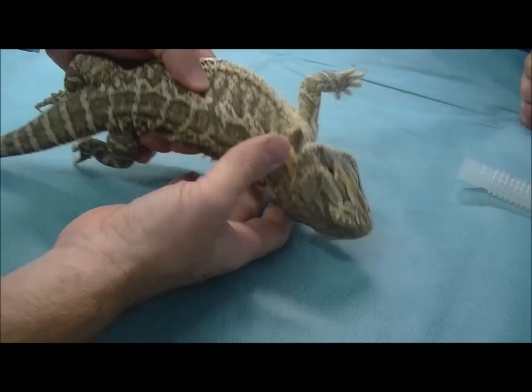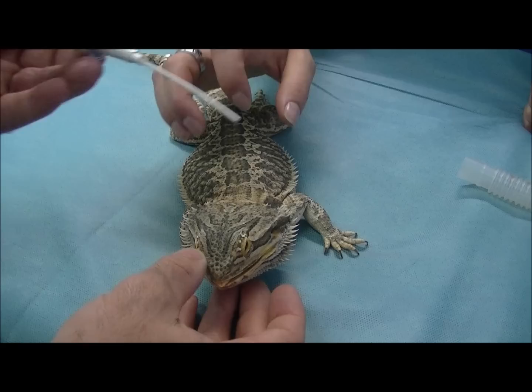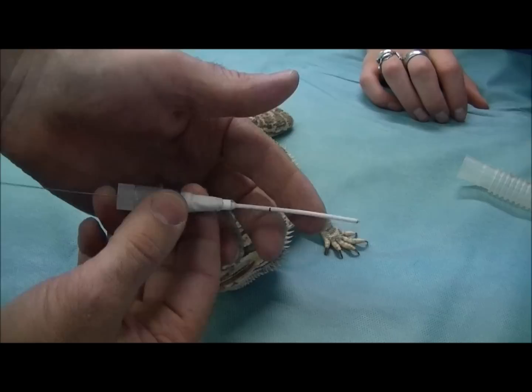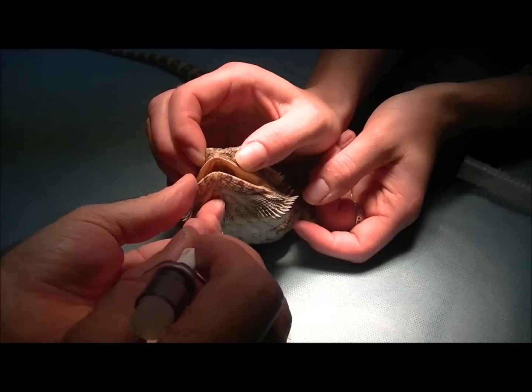We've given her the L-faxan, and you can see now she's anaesthetised. Normally a dragon won't lay like that. She's asleep enough that we can actually open her mouth — you can see quite a fleshy tongue there, and we've got to try and get down behind that. We're going to be using special little ET tubes made for reptiles. They're a silicone-based tube. We've made some modifications — they're normally a bit longer but we've cut them down shorter, and I've put some white electrical tape on them because they're quite delicate and the teeth can sometimes puncture them. We have a stylet inside to stiffen it and make it easier to insert.